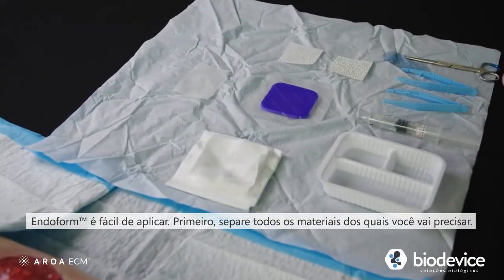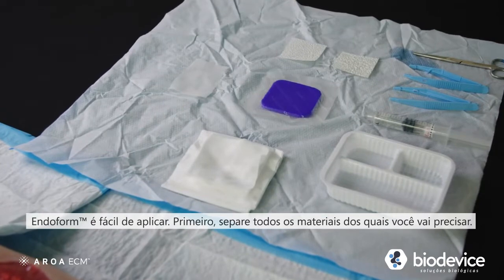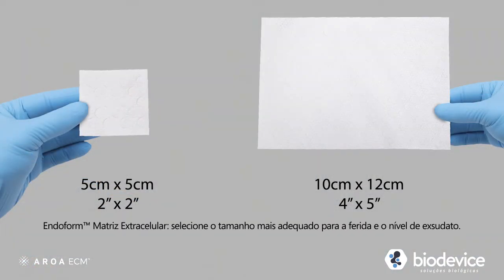Endoform is easy to apply. First, assemble all the materials you will need. Endoform extracellular matrix — select the size most suited to the wound and the level of exudate. Multiple sheets can be used to cover the wound bed as needed, depending on the exudate of the wound.